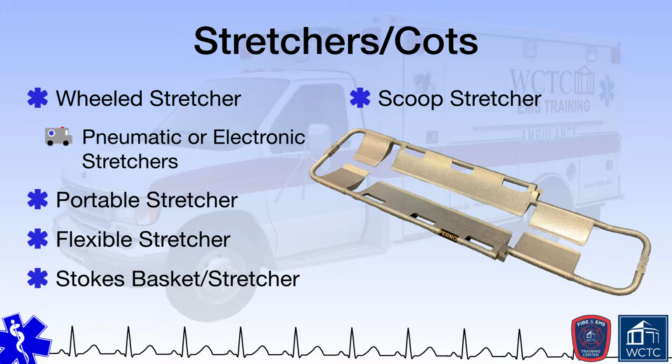Scoop stretchers, also known as orthopedic stretchers, are designed to come apart in 2 or 4 pieces to facilitate application underneath a patient without having to actually move the patient to place him or her on the stretcher. The stretcher is effectively taken apart, wedged under the patient, and reassembled in place under the patient. Once the stretcher is reassembled under the patient, the EMS providers can then lift the patient while on the scoop stretcher to transition the patient to a longboard or a wheeled stretcher for further movement.